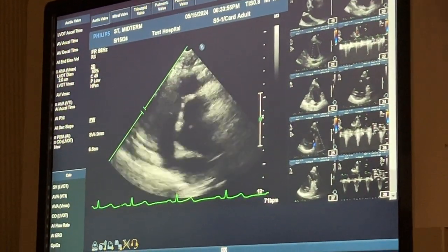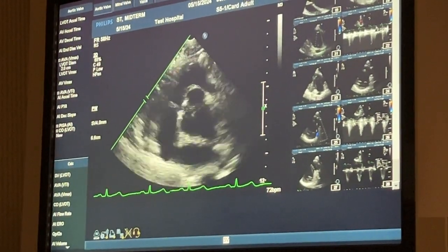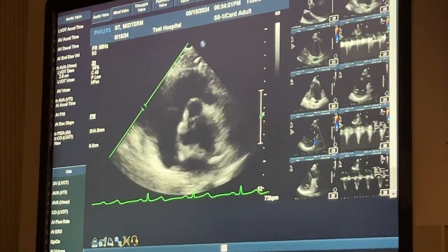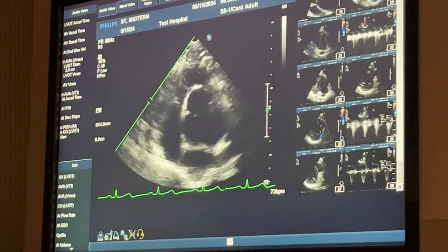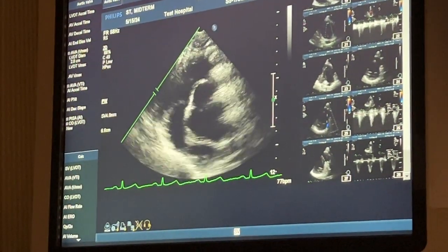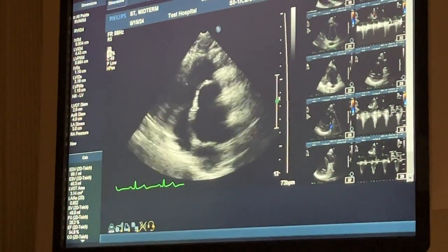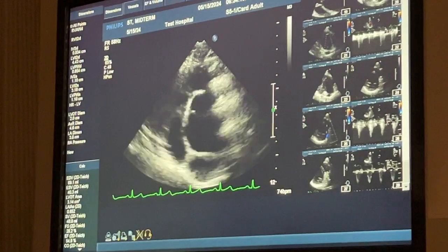Okay, little breath in, and then blow it out. Hold it right there for a second. Breathe. Now remember, with the RVOT, it was hard in parasternal long axis. I didn't actually take my picture. How annoying. It's because I had my pulse wave halfway selected. That's crazy. Do another breath out.